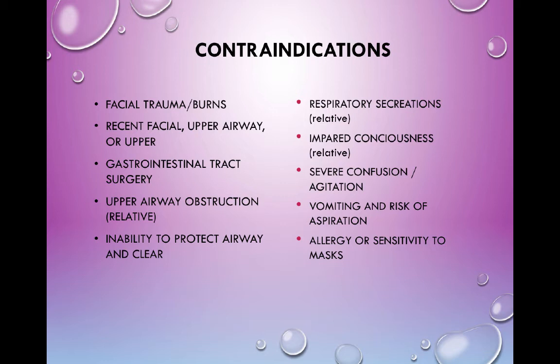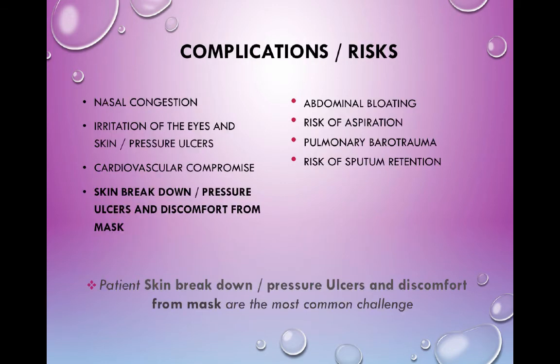Impaired consciousness, severe confusion, agitation. I already said about vomiting. I haven't really seen too many allergies or sensitivities to masks, but I imagine it's out there. Nasal congestion. So blowing in the eyes is a big thing that you hear people complain about, and I'll come back to that in a second. Cardiovascular compromise. I don't know that I've ever seen that, but it's listed as a contraindication or a complication. But it's up there for completeness.